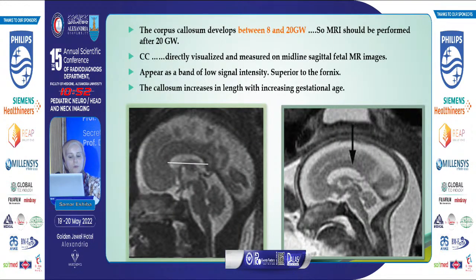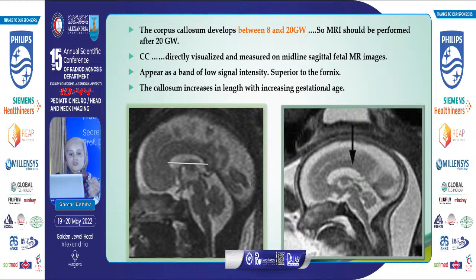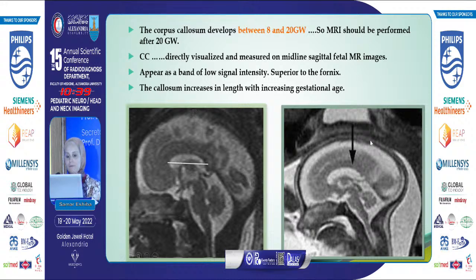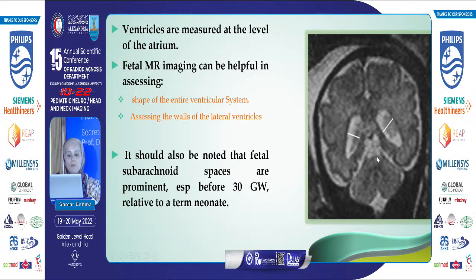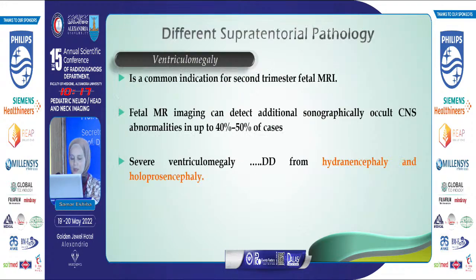We can also assess the corpus callosum, which develops between 8 to 20 gestational weeks. MRI should be done after 20 gestational weeks to assess the corpus callosum, which is directly visualized and measured in the midline sagittal fetal MRI as a band of low signal intensity superior to the fornix. We can also assess and measure the ventricles at the level of the atrium, with MRI helping to assess the shape of the entire ventricular system and the wall of the lateral ventricles.